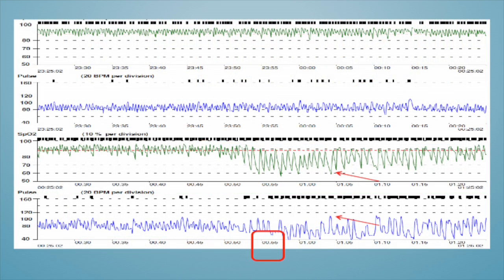An hour-by-hour pulse oximetry trace — very sawtoothed and jagged. Over one section there's probably a REM-related hypoventilation moment, because effort decreases during REM. On the time index you can see a sharp desaturation followed by a sympathetic pulse spike — the oxygen drops and the pulse goes up.